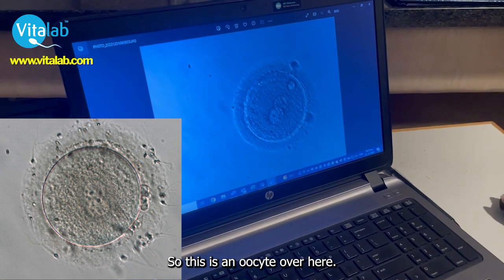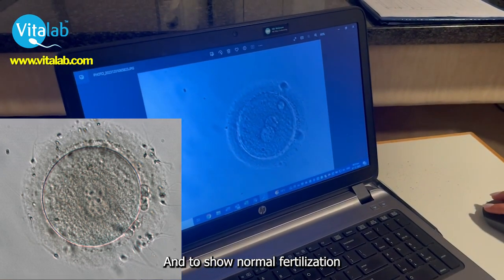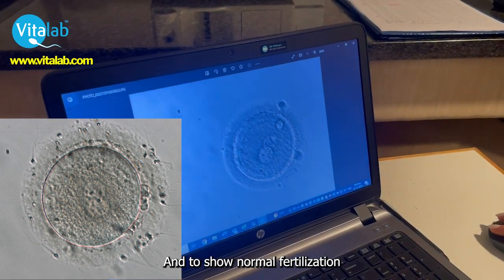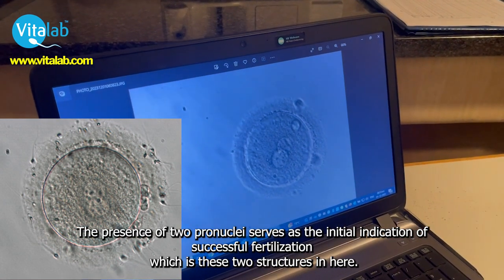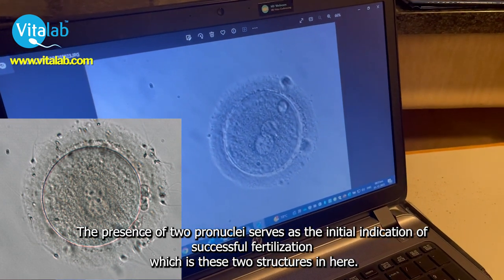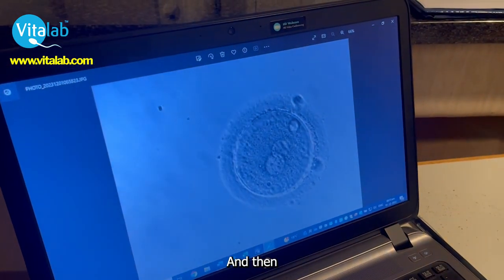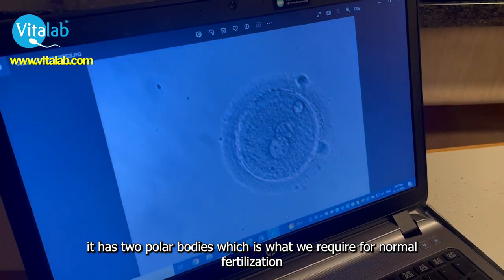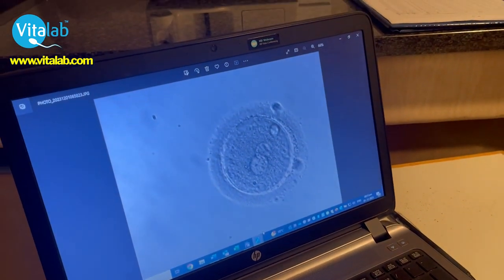This is an oocyte over here. To show normal fertilization, we need two pronuclei, which are these two structures in here. And then it has two polar bodies, which is what we require for normal fertilization.